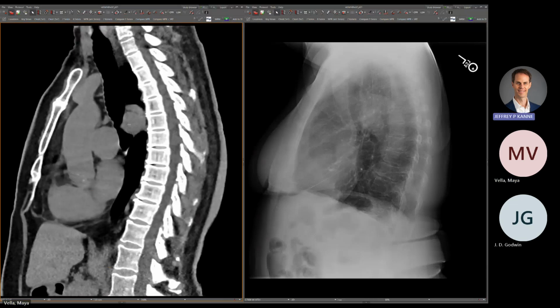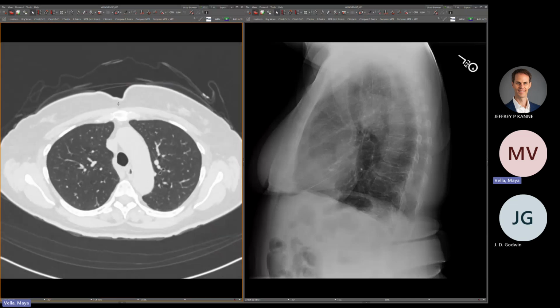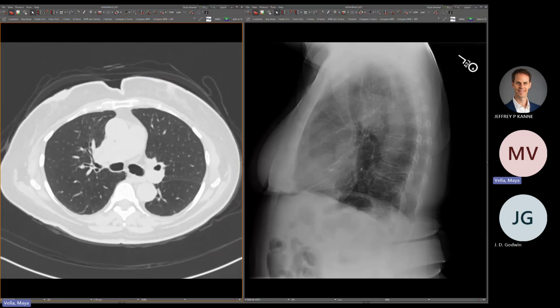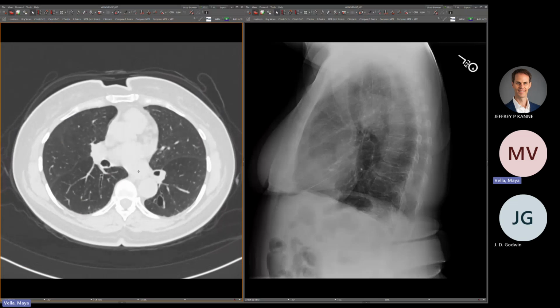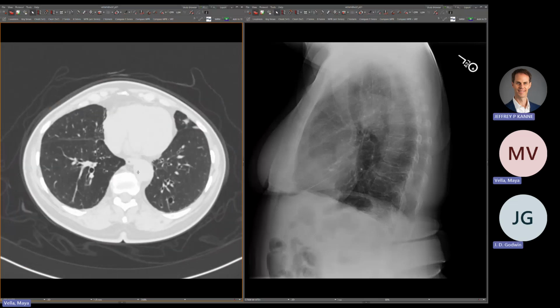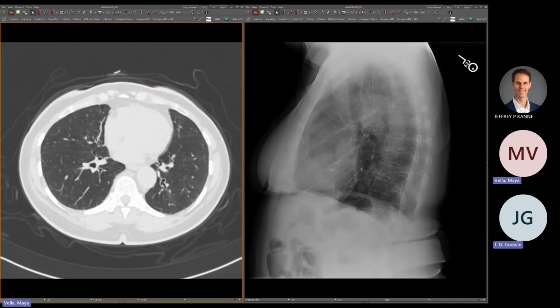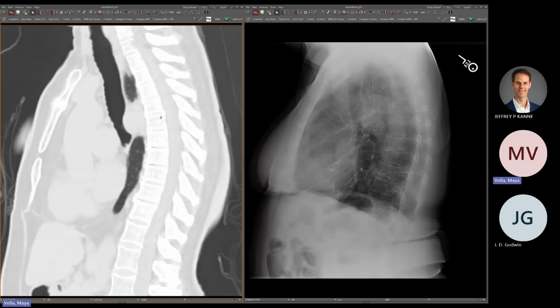Cool. Are there any airway anomalies? Let's see. I don't remember off the top of my head, but let's check. Besides that narrowing? Yeah, just a little narrowing there. The little whatever schmutz hanging out. No funny branching or anything. Could you show us a sagittal of the trachea? Just make sure we don't have indentations from complete tracheal rings around behind. Good question. No, nice and smooth posteriorly. Yeah.